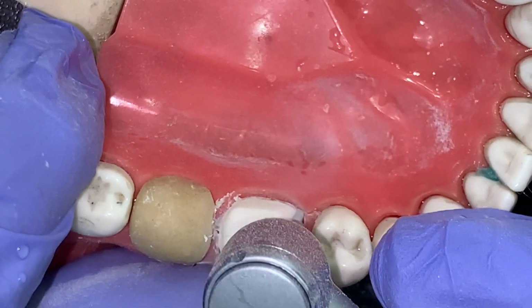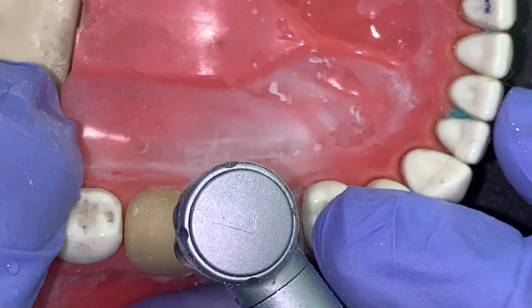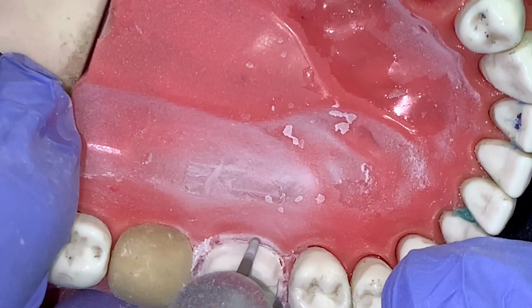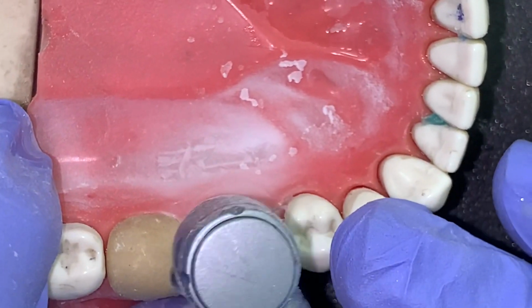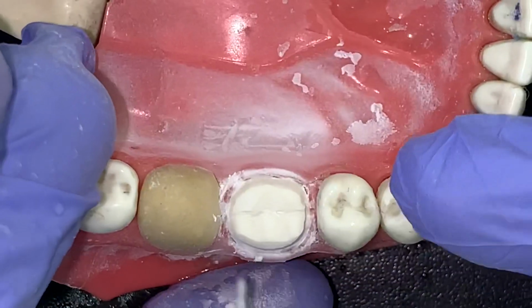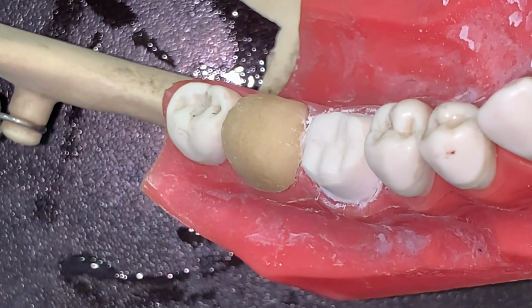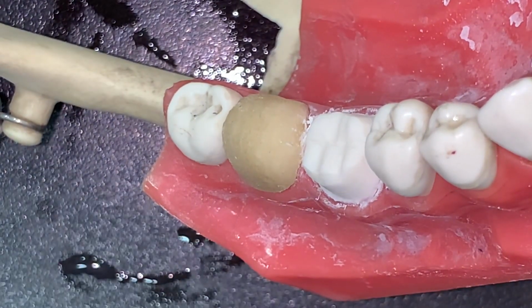So as I told you in the starting, you can spend a further 10 to 15 minutes at every point of your crown preparation just to check whether your margins are visible from the occlusal view. You don't have any undercuts or any underprepared tooth surface. If you are passionate about your work, there is no time limit that you have to spend on a tooth preparation. At every point of time, there is some further improvement that can be done in your tooth preparation.